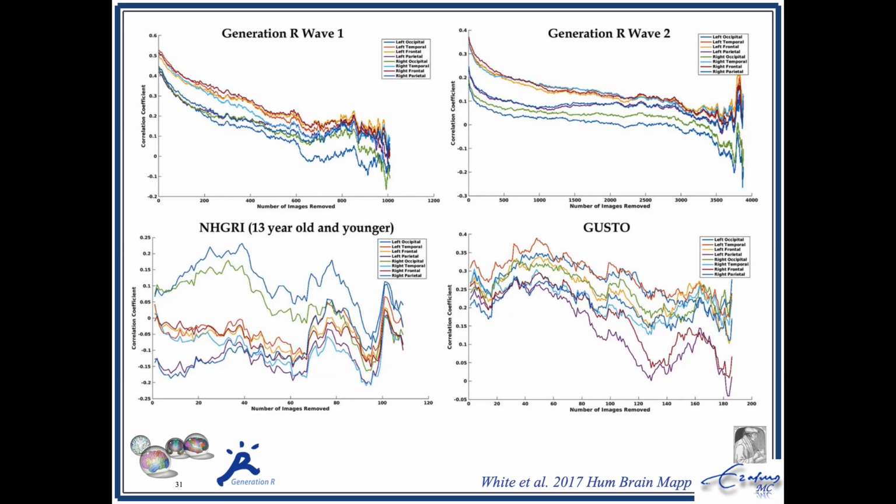Why is that? I'm not following, because wasn't that originally trained and optimized to detect issues in quality? Yes, it was trained, but not on the measure of cortical thickness. But thickness has a direct relationship with quality. Actually, it depends on how well you QC'd the FreeSurfer outputs, and I think that's what this shows. So are you saying that thickness values follow the quality of the FreeSurfer output?